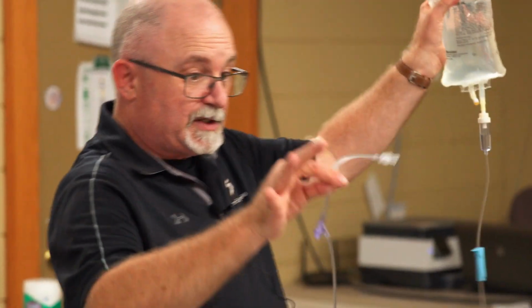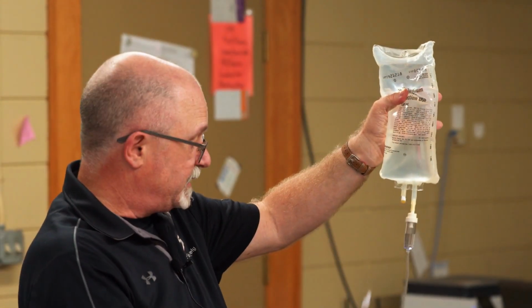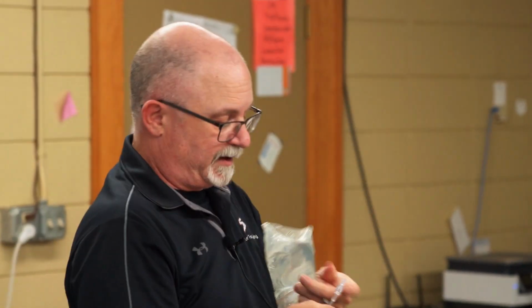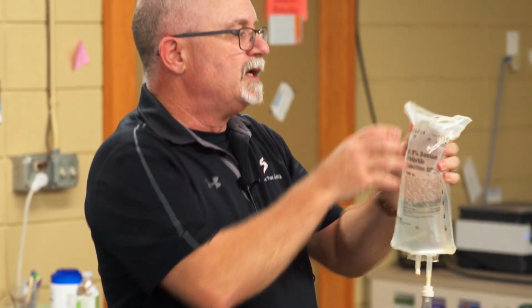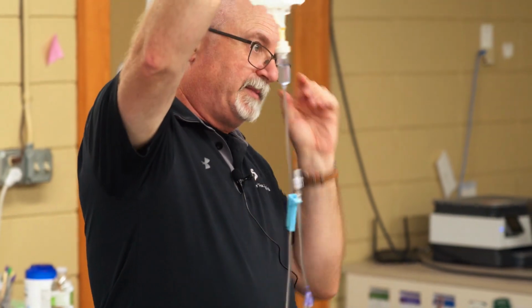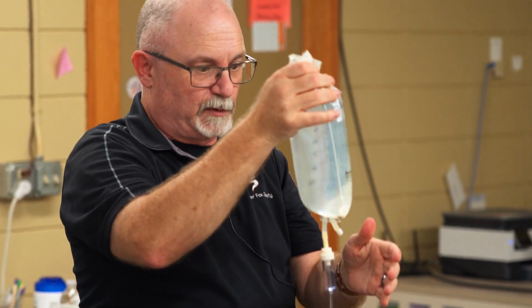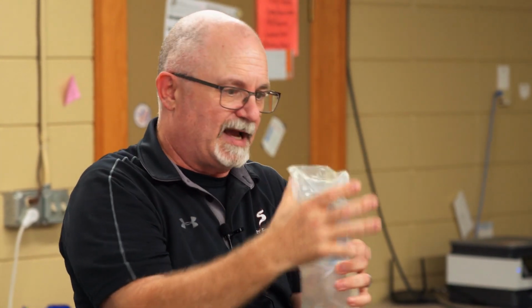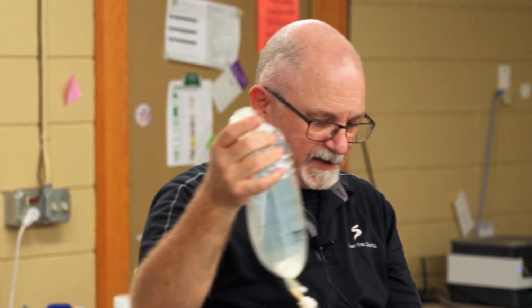All right, so now we're set and we're ready to go. This still is on, and so we're still protected there. Theoretically can do this. Ooh, look at that. We're kind of cool, right? So the higher up it goes, the better pressures you can get. We can go into really crazy if you really want to put a lot of fluids in. There are pressure bags, or you can squeeze on it if you really got to get somebody in there, for giving adenosine or something like that, which you guys aren't going to be, so no big deal.